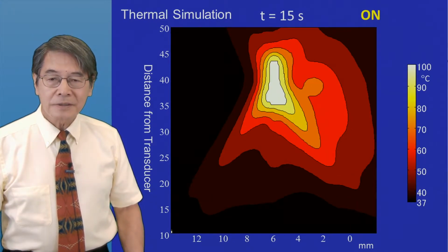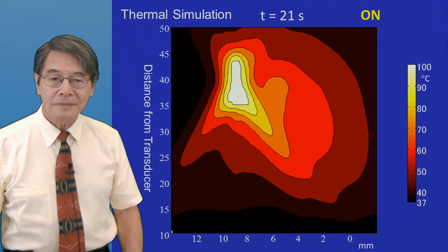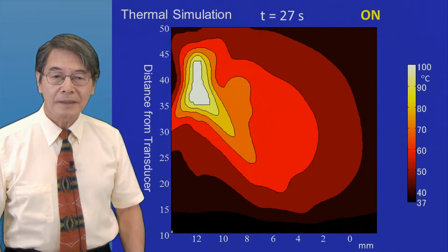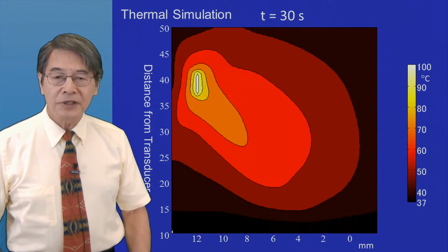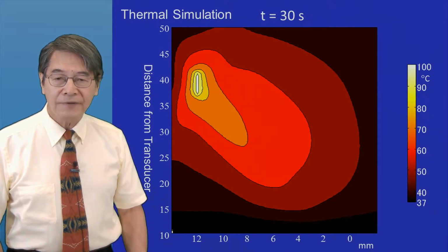It continues, continues. This is the temperature distribution 30 seconds after the start of the HIFU exposure.